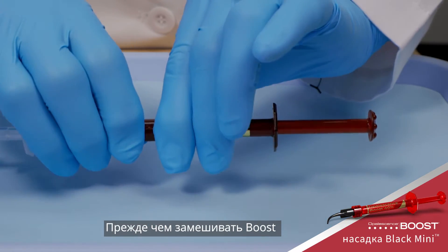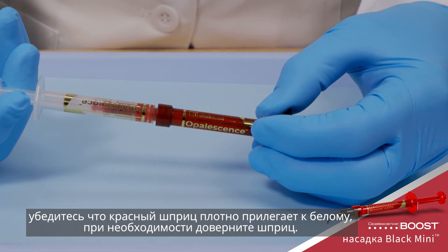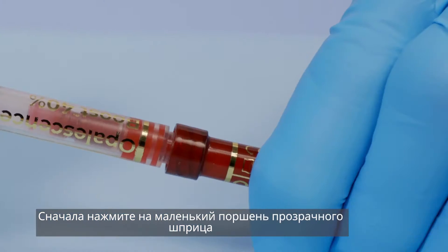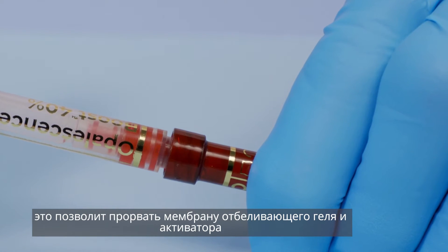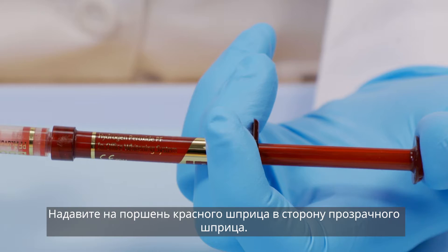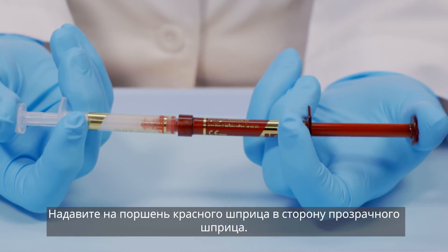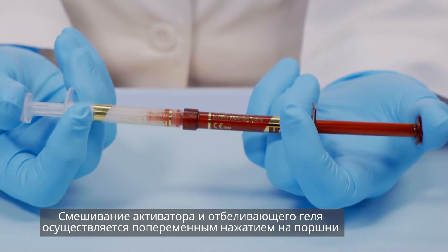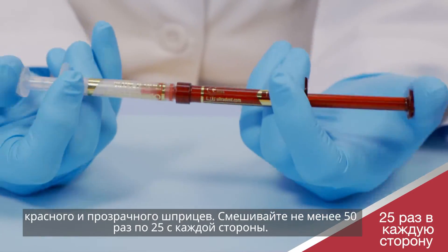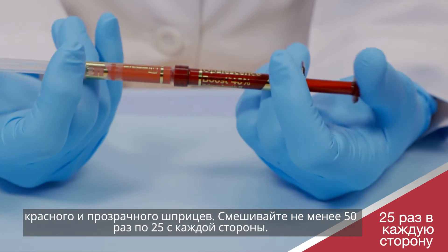Before mixing Opalescence Boost whitening, check that the red syringe is securely attached to the clear syringe. Depress the small clear plunger into the middle small clear syringe to rupture the internal membrane and combine the whitening gel and activator. Press the red plunger completely back into the clear syringe. To thoroughly mix the activator with the whitening gel, push stems back and forth continually with thumbs and mix a minimum of 50 times rapidly — 25 times each side.